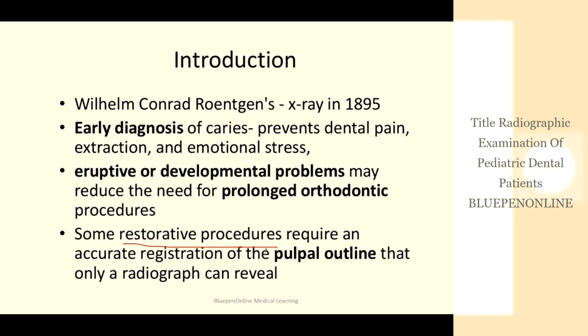Thus, from the last section also, we had learned how to come to a final diagnosis. That is, with the help of X-rays or the investigations, we usually come to a final diagnosis. So, radiology is one of the commonly used methods in order to come to a final diagnosis.